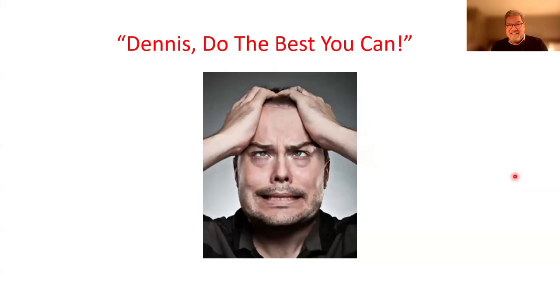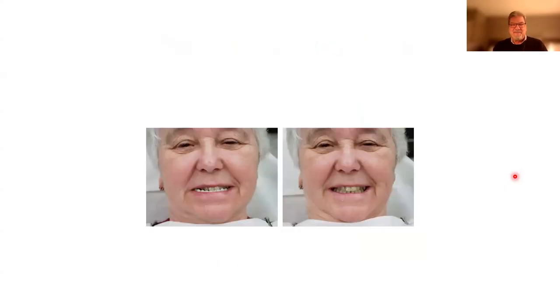Dennis, do the best you can. So I said, Doctor, I can't do the best I can. Let me make an occlusal rim for you. It was an immediate denture, so I got a new impression, made a new occlusal rim, and the case worked out fine. So taking the occlusal registration, look at this patient here.